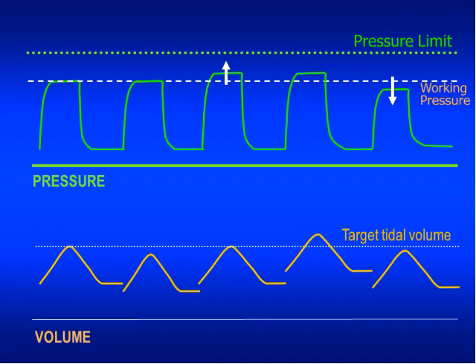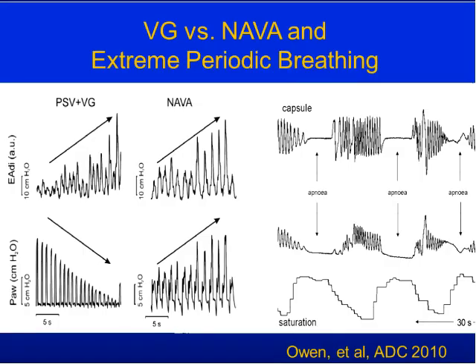This is also compensated for leak to some degree. I'll talk about leak compensation in a moment. There is a real-time, within-cycle monitoring of tidal volume as well, and if it exceeds the target by a large amount, it will terminate the cycle. So there's, in a way, a dual control, but that's a secondary one. The primary control is on the exhaled tidal volume. So you can see that if there are large changes, it may take a little bit of time for the tidal volume to stabilize again.